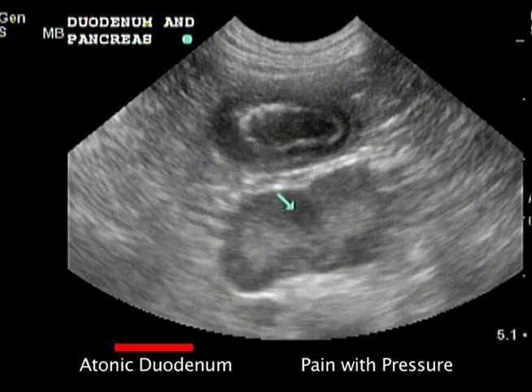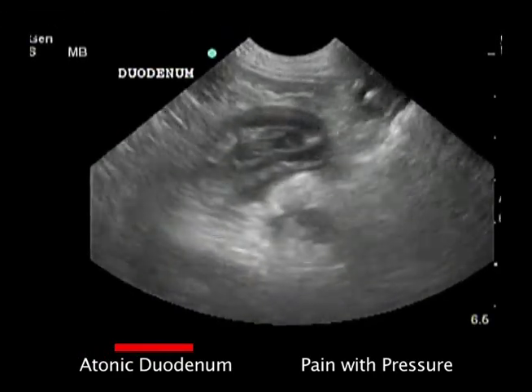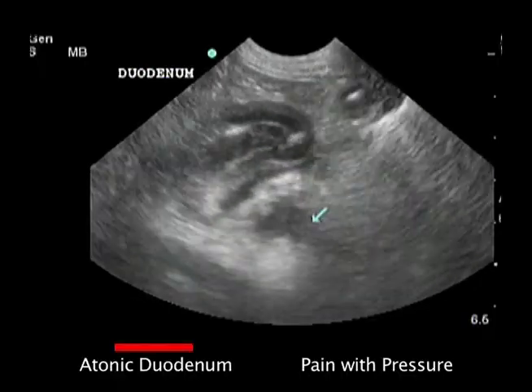Note the irregular thickening of the mucous membrane layer of the duodenum in this 3-year-old German short-haired dog with pancreatitis. This 11-year-old pug has had anorexia and severe depression for 2 days.